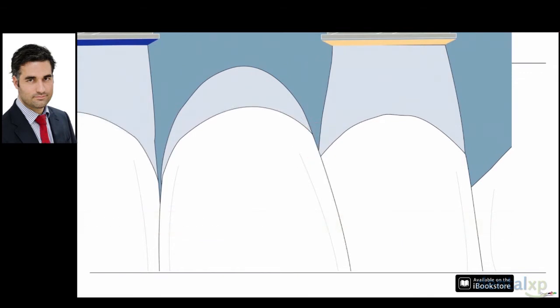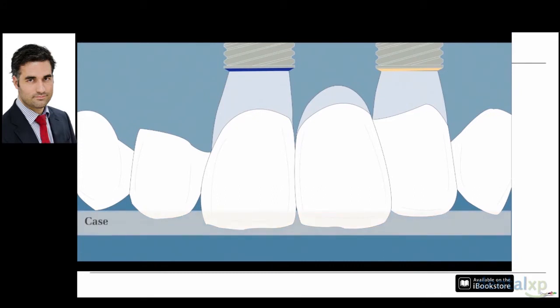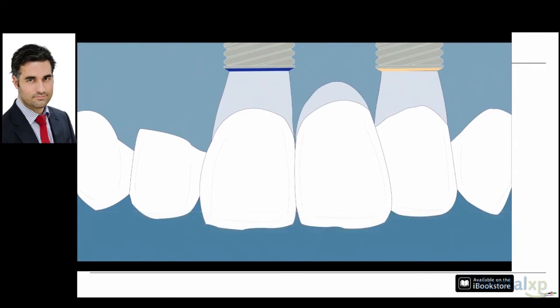from Tarnow that if you have 5 millimeters, you have a high probability of filling with papilla, and if you have 6, there is less probability, but you still have probability of papilla filling of your contact point. In this case, it was more or less 5 millimeters. I decided to push it 1 millimeter coronally. So these were the changes that I did to my provisional.